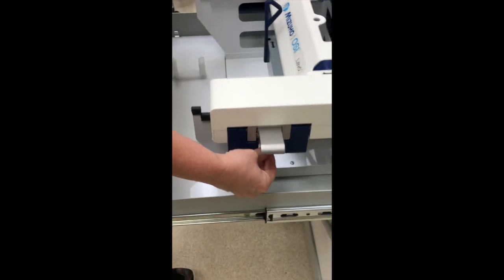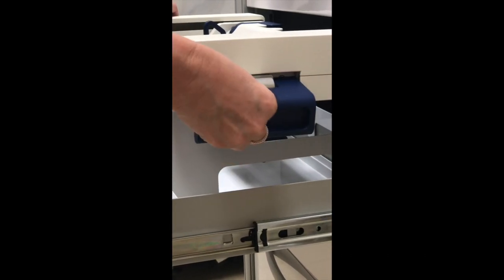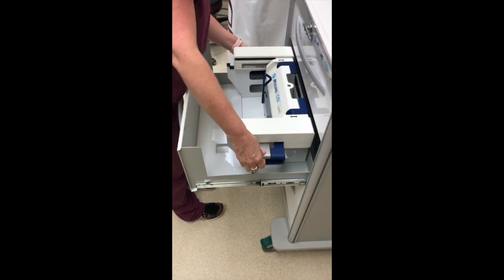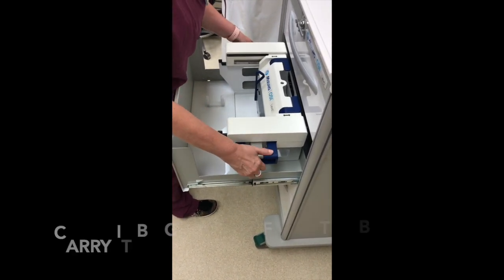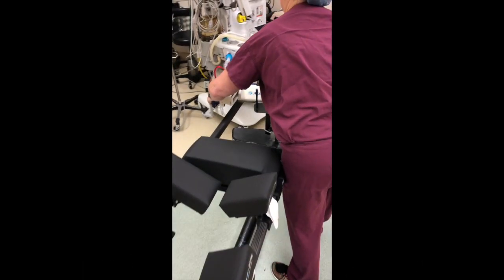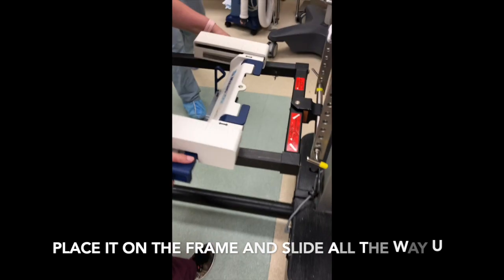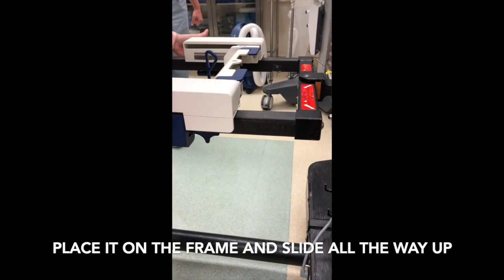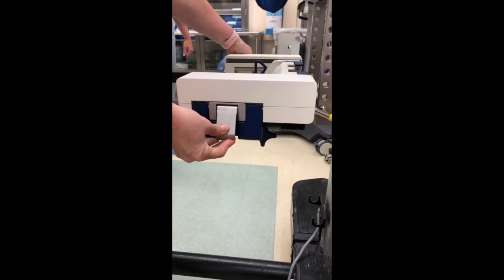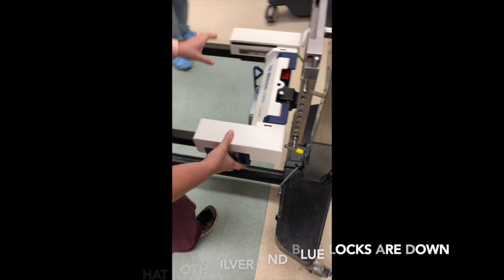There is a two-lock mechanism. You're going to push down on the silver lever and lift up on the blue bar, and then you have your second lock with the silver on top. Do that on both sides. Carry it over to the table by the blue handles or locks and place it on the table. The blue locks will go down. Move it up towards the head of the bed, and then push down on the second lock to lock it in place.